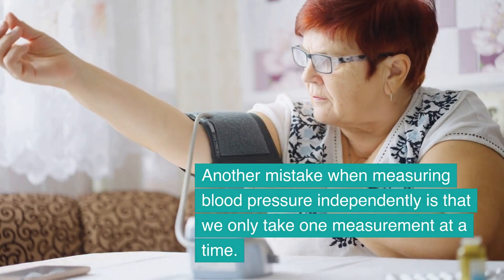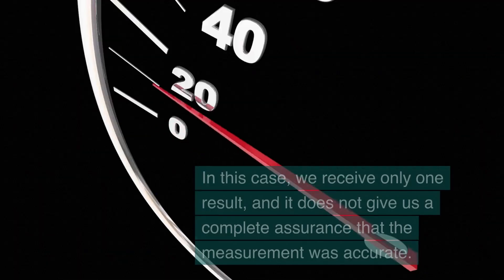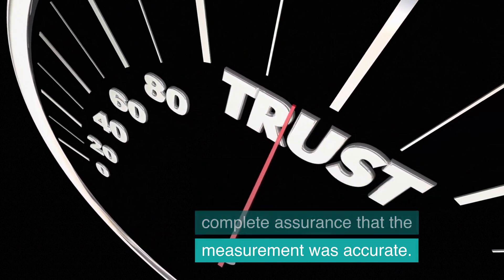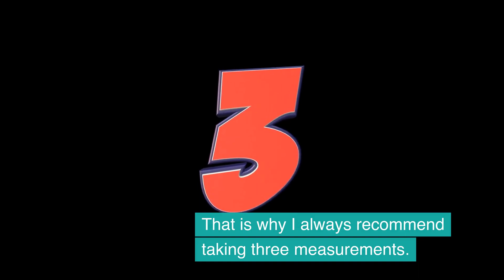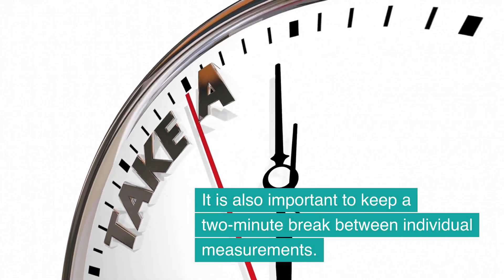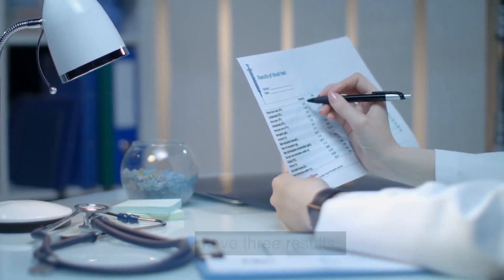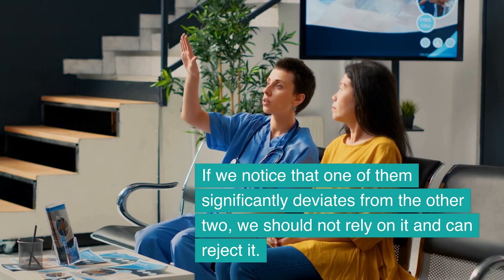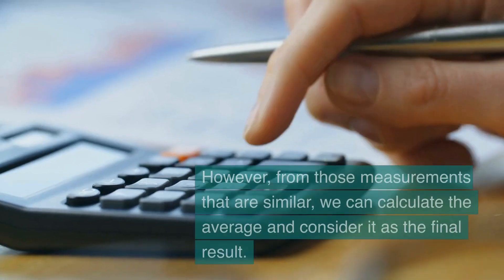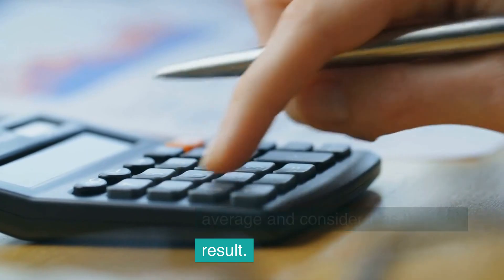Another mistake when measuring blood pressure independently is that we only take one measurement at a time, which does not give us complete assurance that the measurement was accurate. I always recommend taking 3 measurements, with a 2-minute break between individual measurements. If one result significantly deviates from the other two, we should not rely on it and can reject it. From those measurements that are similar, we can calculate the average and consider it as the final result.